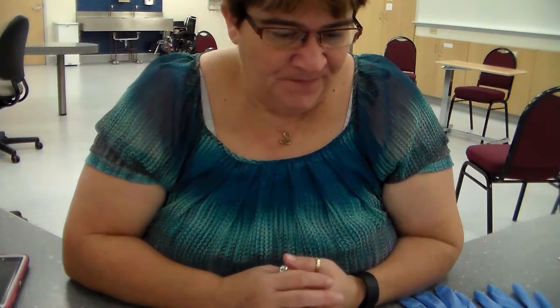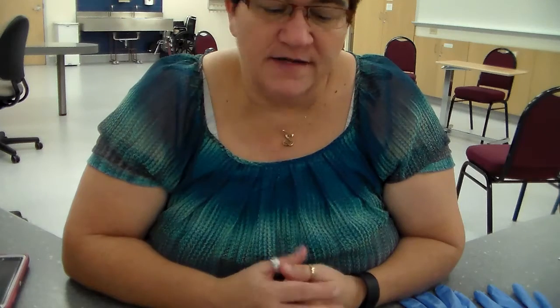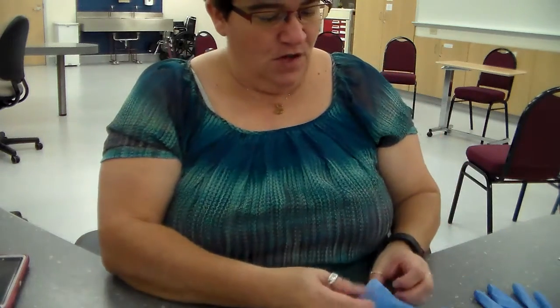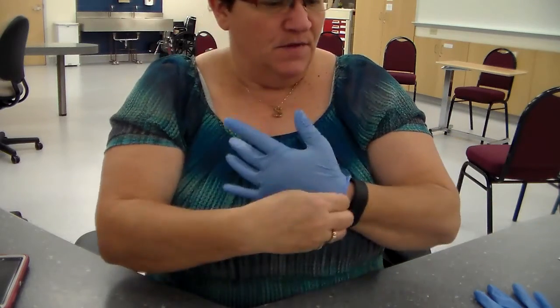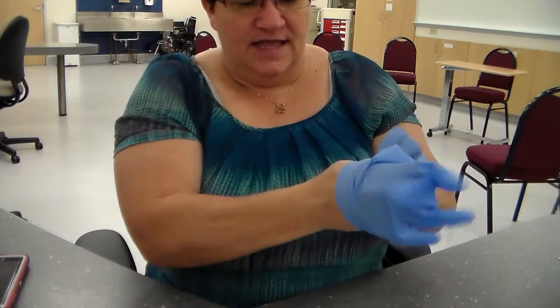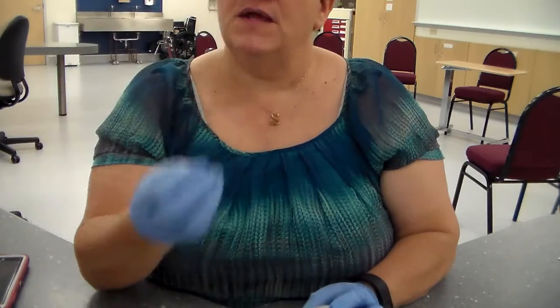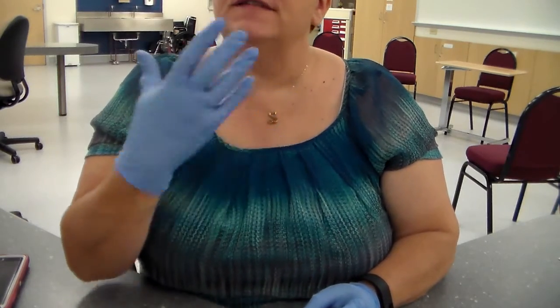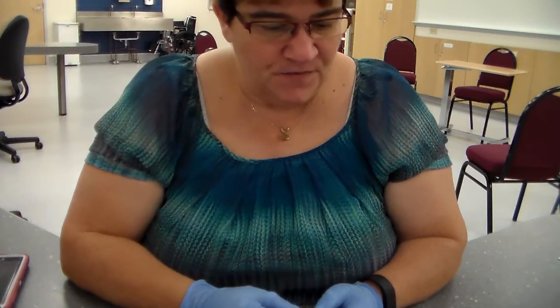Don't forget that. And then you're going to compare it to the MAR in the client's room or when you're ready to leave the medication preparation area. You're going to go to your patient's room and you're going to perform WIPSA. Now, you're going to be dealing with the mouth again, so it's okay to put on gloves. So go ahead and put on your gloves, and assist the client to a comfortable sitting position. It's easier for a client to inhale when they're sitting up than it is to be laying down and trying to inhale.